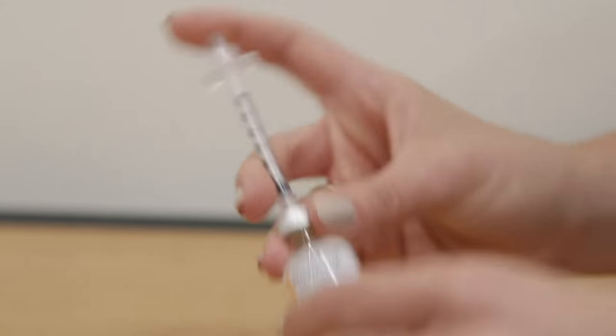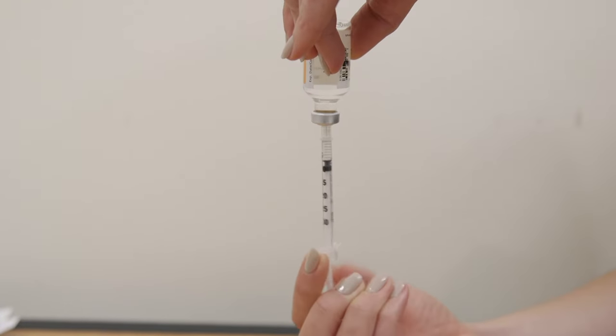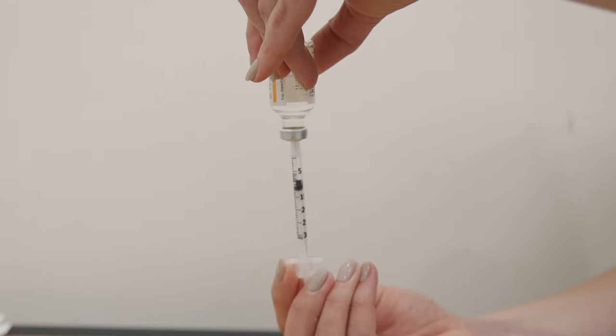Turn both the vial and syringe upside down. With your free hand, pull the plunger to withdraw the correct dose into the syringe.